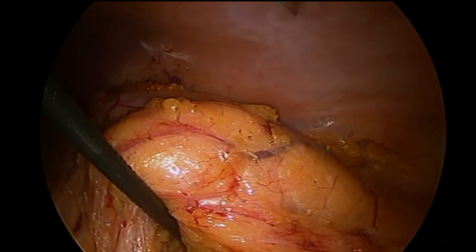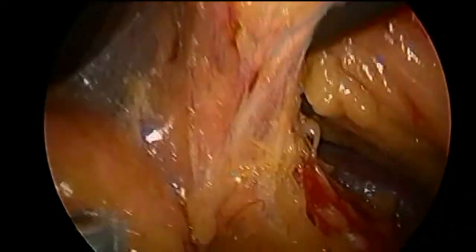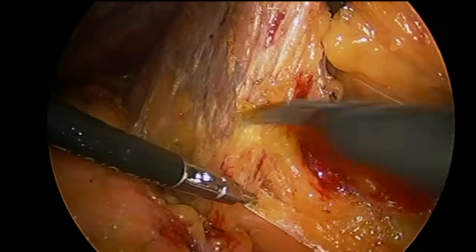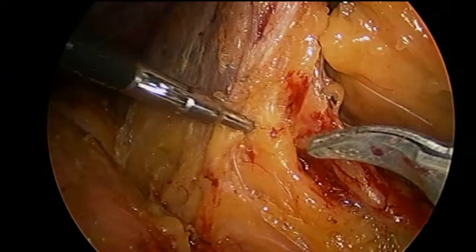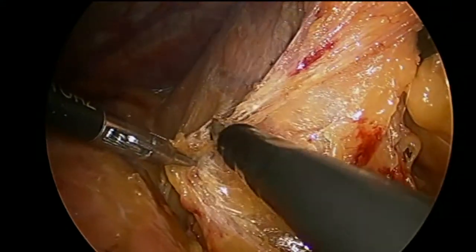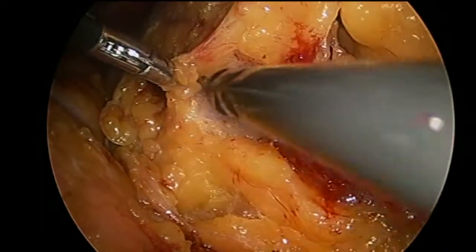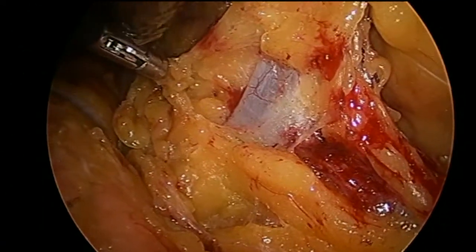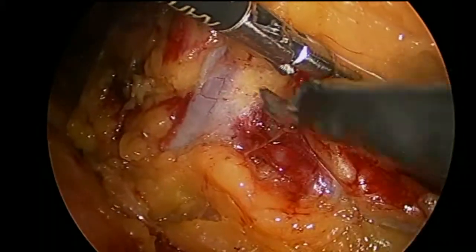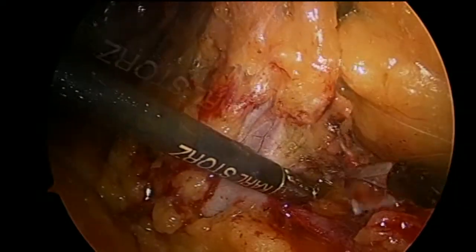I'm inserting another retractor. I use a fixed retractor with either a metal pointer or a laparoscopic peanut to lift the kidney up. This means I can then operate and dissect the hilum out with two hands using sharp dissection rather than bluntly dissecting with a sucker and hoping for the best. This is all part of mobilizing and opening up Gerota's fascia anterior to the renal vein. Once it's fully open, we can then usually find the adrenal vein as well. It's important to go medially. Other structures to note on a left nephrectomy would be the lumbar veins, which often wrap around the artery and join the renal vein, often preventing exposure of the artery.